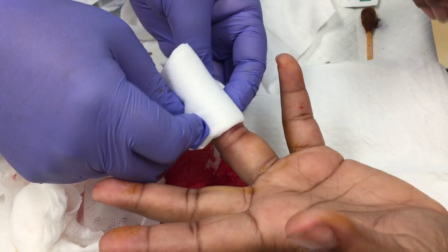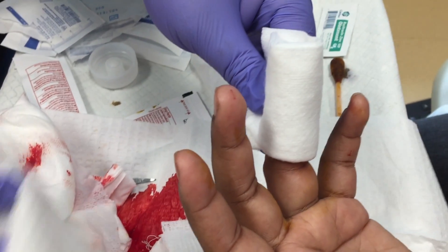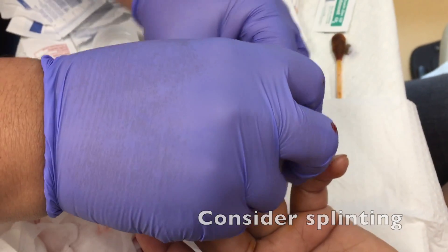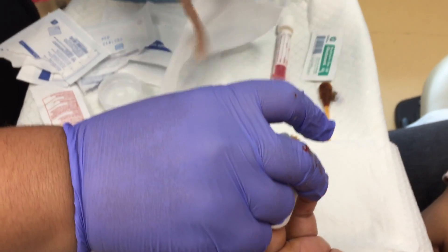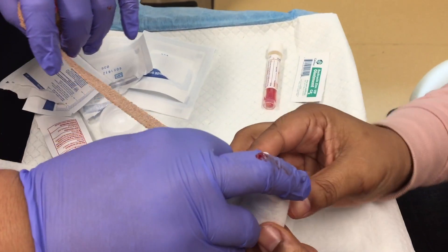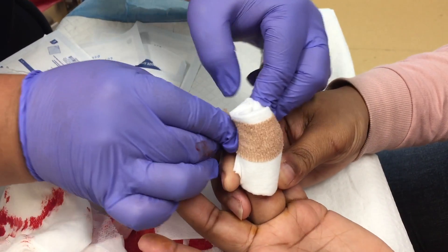Next you'll want to construct a bulky dressing to handle any further drainage or bleeding from the wound. You'll typically want to splint the fingertip and encourage the patient to keep that finger elevated when they go home. They can remove the dressing in 24 hours and begin warm soaks at home to facilitate further drainage from the wound.